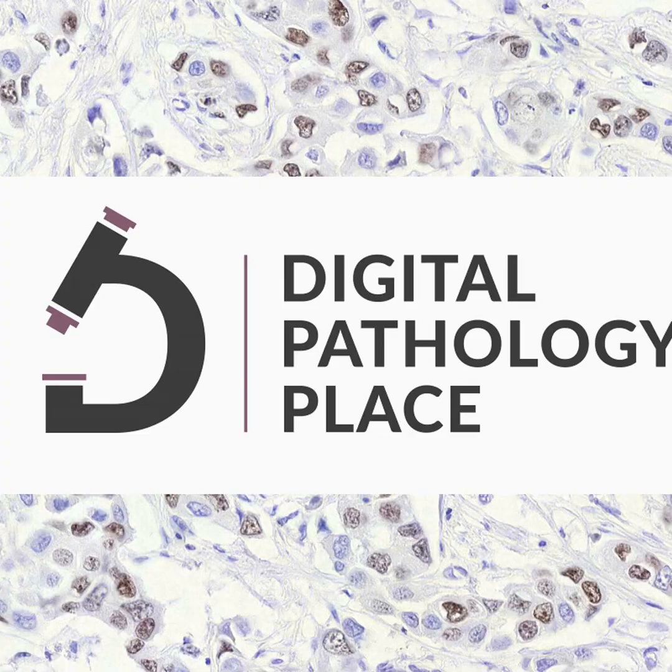vast and overwhelming for a computer program to process all at once. Therefore, these large images are often divided into smaller sections called patches or tiles. This technique, known as patching, facilitates the handling and processing of large images. Once a model is trained on these patches, it can conclude about objects and regions in the whole image.